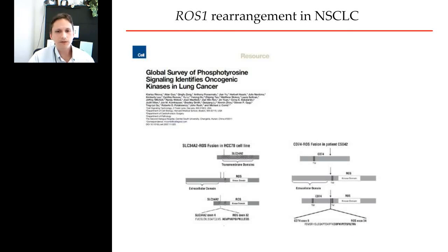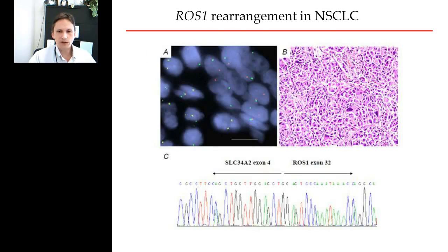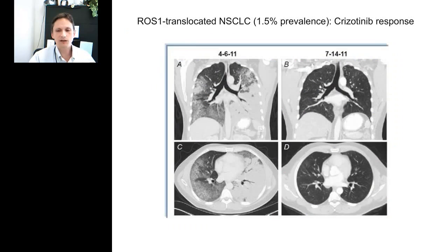I think everyone's heard enough probably about FISH. About the same time that we started working on ALK, the ROS rearrangements were described by the Cell Signaling group here up in Boston. Also a receptor kinase, structurally related to ALK in the kinase family. And as we found out later, also primarily in young non-smokers. So we began to screen for ROS patients by FISH at the same time. ROS FISH is a little bit easier than ALK FISH because the genes generally are farther apart. And like ALK, the response of ROS-positive patients to crizotinib has been phenomenal.